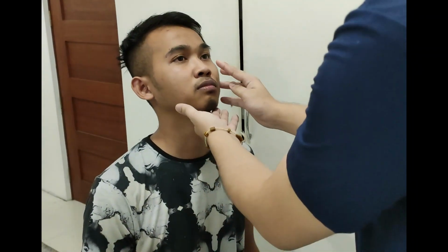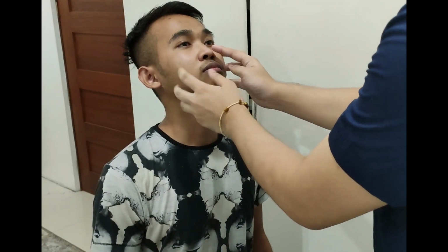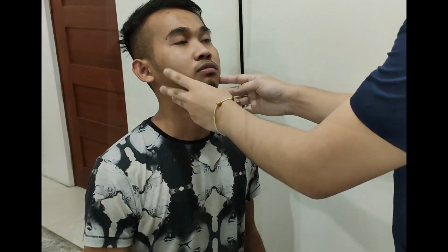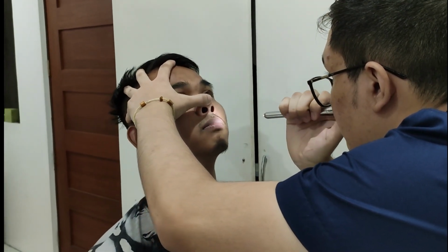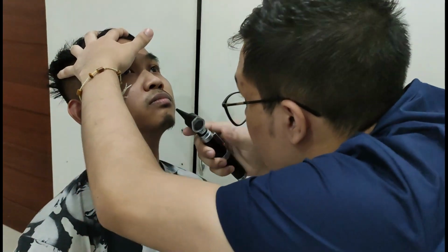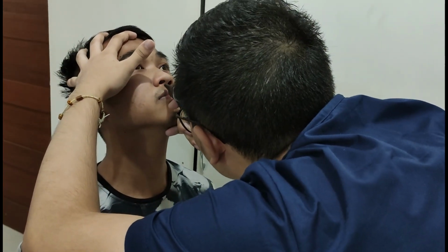Okay. So I'll be testing for nasal obstruction. Sir, can you please breathe in? Okay. Here, with the help of a pen light, I will gently press the tip of the patient's nose to get a partial view of the nasal vestibule. Next, with the help of an otoscope with the largest available ear speculum, I inspect the inside of the nares of the patient.